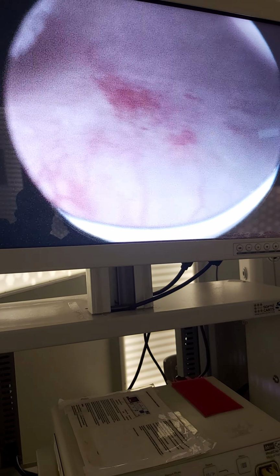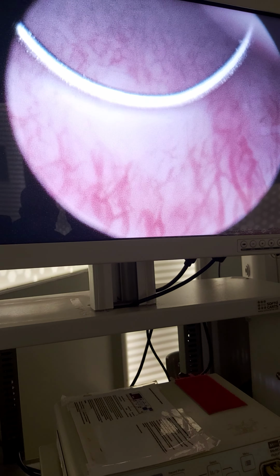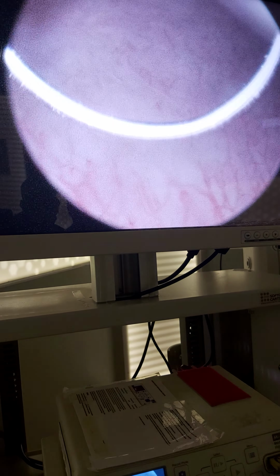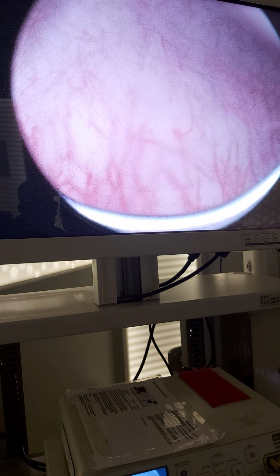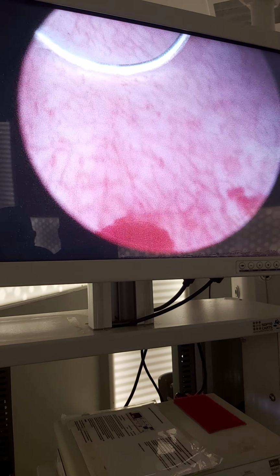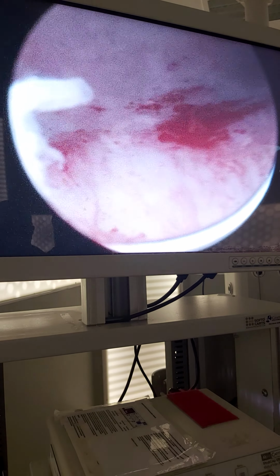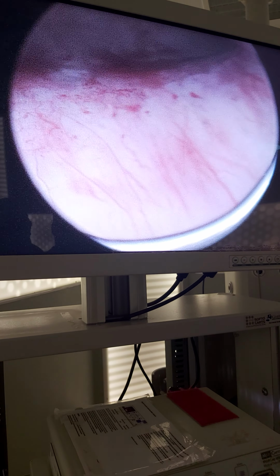When urine acid is touching to these tissues, they make too much irritation. Look at these membranes. Tissues are coming off when I just scrape them and they bleed. I want this part to be like this, but I want the other bladder walls to be totally healthy. And now we will control.